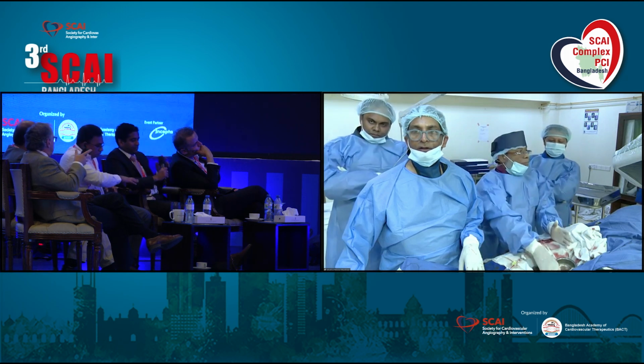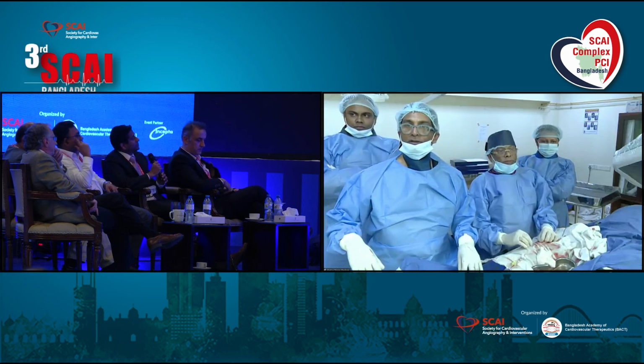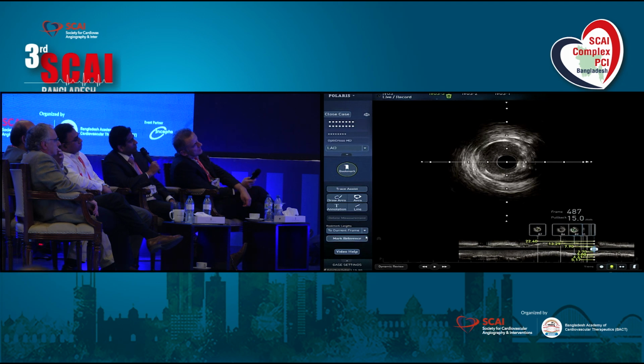Okay. IVUS, we cannot see the IVUS. Can you show that to them, please? And measure that, from EEL to EEL over there. Measure that EEL. No, don't move that one. Don't move that one. Yeah, good. That's good. EEL to EEL. Go a little bit higher. Oh, 3.3. EEL. Good.